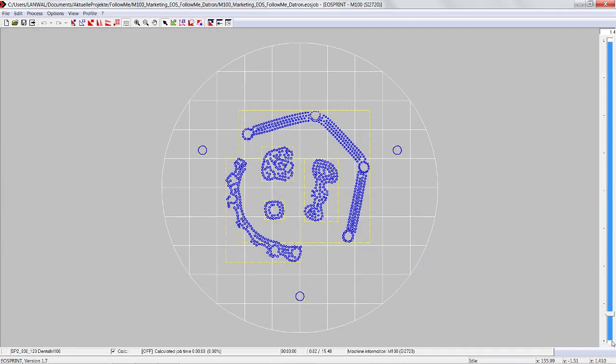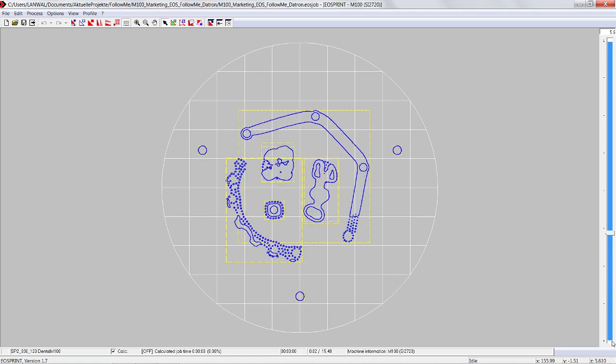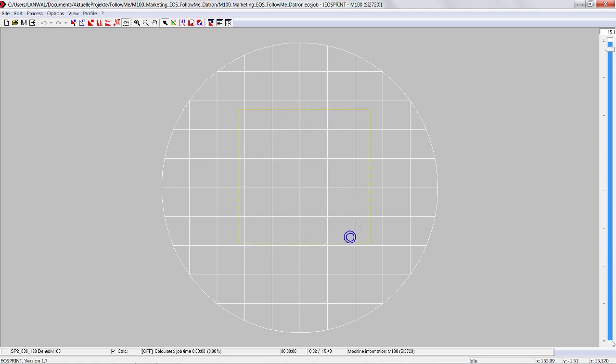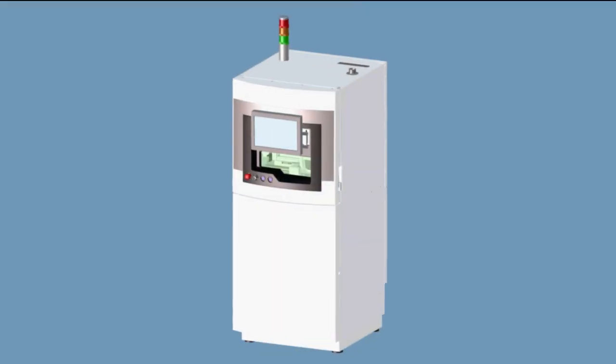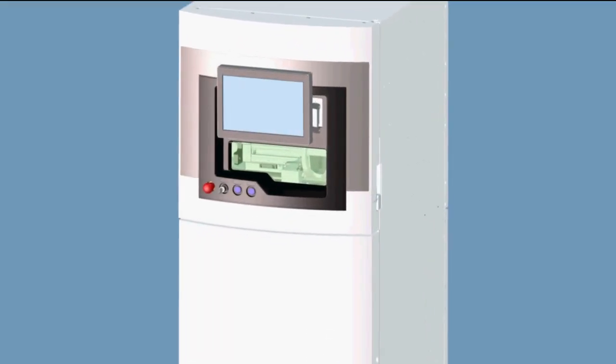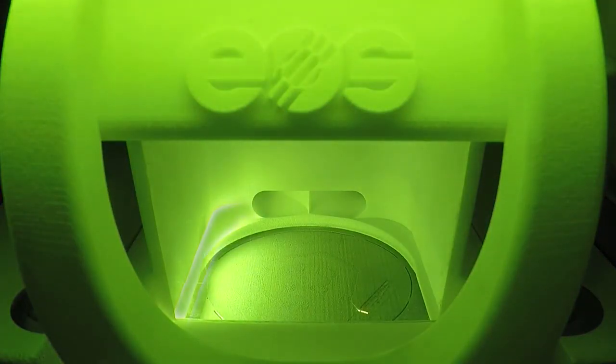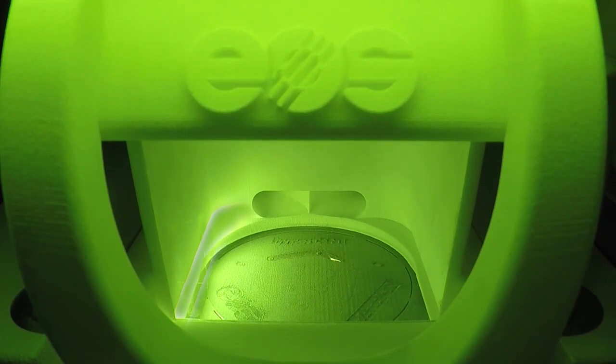The slice files are loading into EOS print and the building task is exported to the M100. The M100 is equipped with a 200 watt laser and a focus size of 40 micron. The certified process builds dental geometries in 20 micron layers. The building time for a full platform is around 4 hours, depending on the Z height and the exposed area.